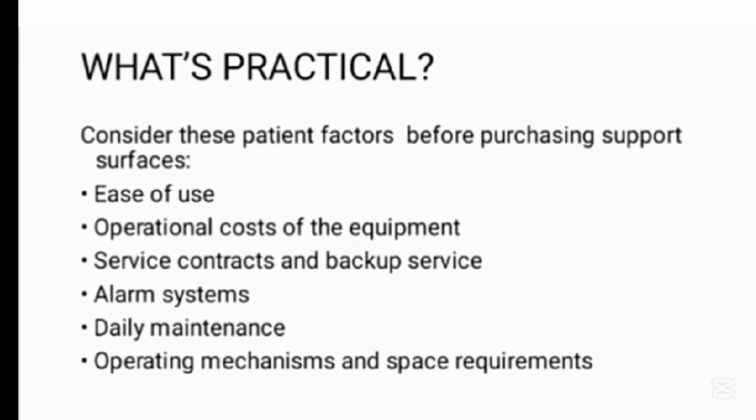So today we talked in detail, with a complete lecture, about pressure redistribution, including its positioning, support surfaces, and its management and treatment.